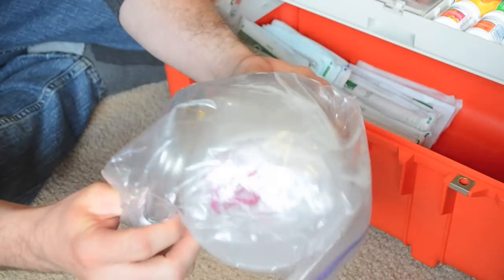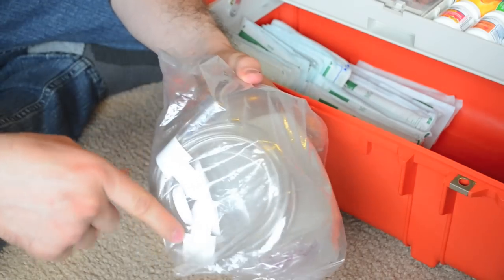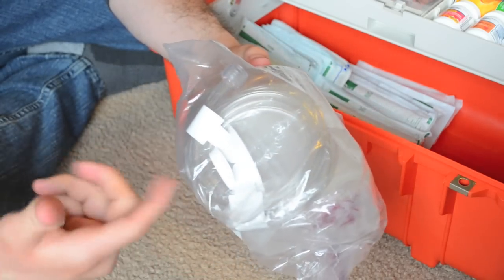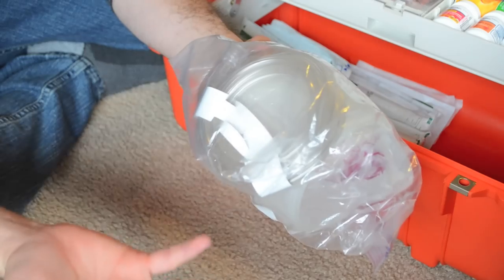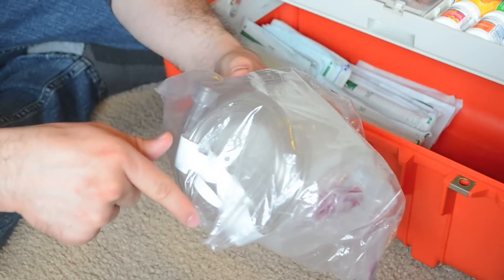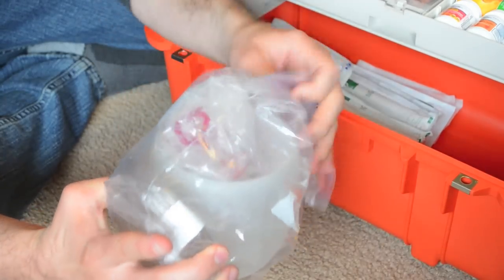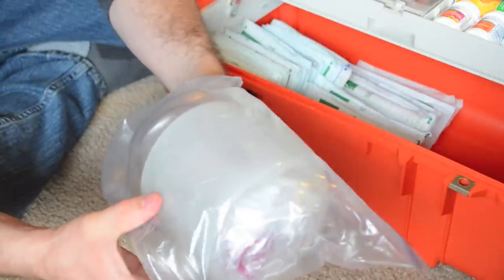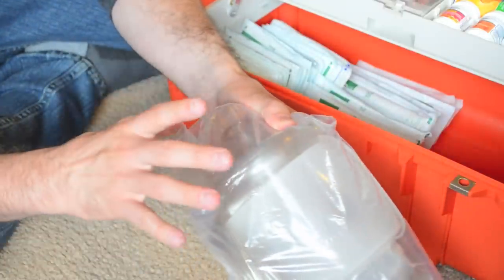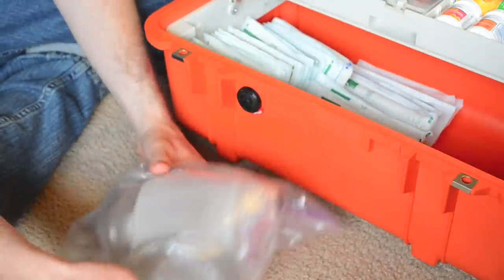The last thing I've got in here is a BVM. In here I've got oxygen tubing just in case — I don't have oxygen at the house, but if I use this, 911 is going to be called and they have oxygen, so we can plug this directly into oxygen. There's an adult mask in here. I don't carry any pediatric masks but I am going to get some. I have two children of my own, so if you have kids, I recommend having pediatric versions just in case.